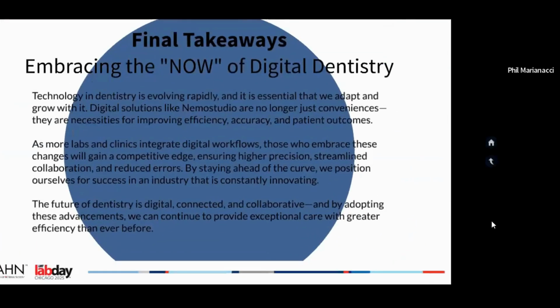So what we view is, is this here now, or do we want to start doing something like this now? Do we want to start doing surgical guides? Because I know a lot of you that are on here, you're not doing a ton yet of surgical guides. I would say get yourself trained and comfortable, because this is a great way to build your business.